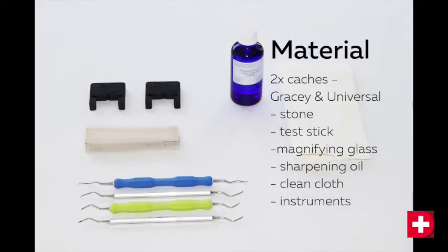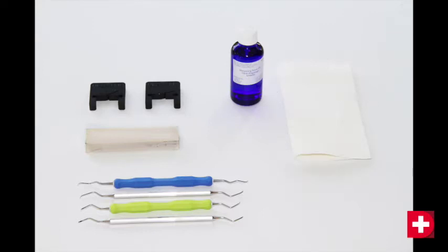You will need the following: two EasySharp Coaches, a stone, a test stick, a magnifying glass, sharpening oil, a clean cloth, and of course, the instruments that you want to sharpen.